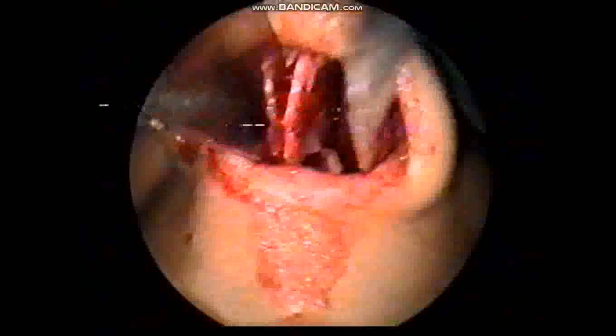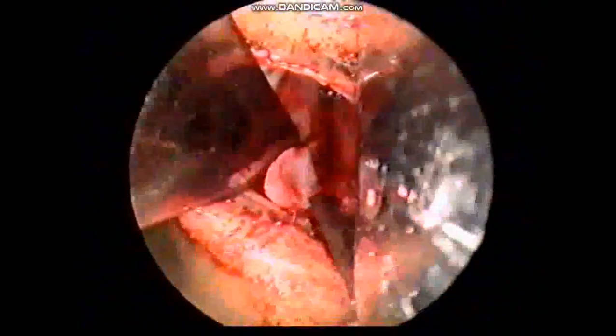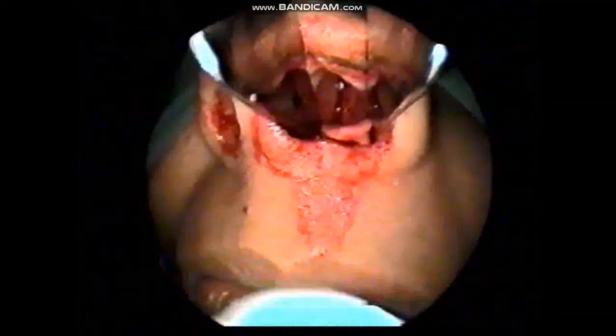Now you can see the septum in between the two blades of the nasal speculum, and I am making a small cut in the inferior part of the septal cartilage. You can see the incision made on the lower part of the septal cartilage from front to back, and this small strip of septal cartilage is removed. There you can see the inferior strip of the septal cartilage coming out. Catch it with the Luc's forceps and remove it.